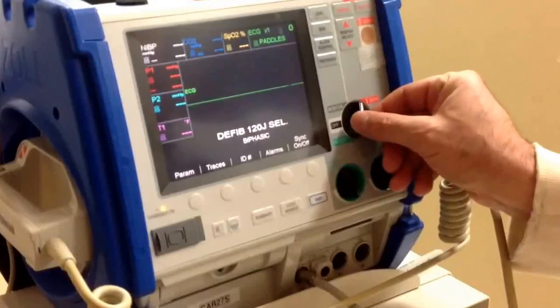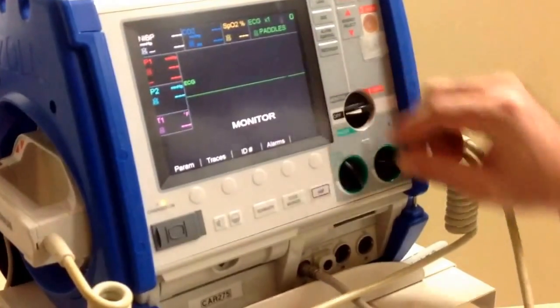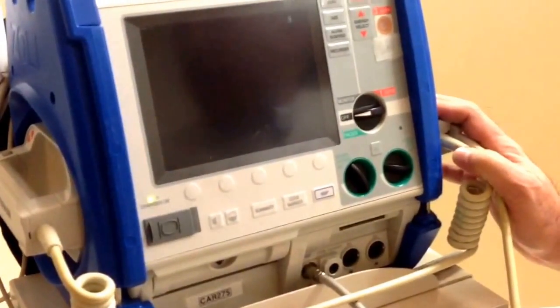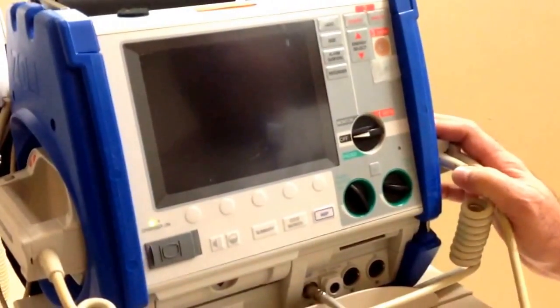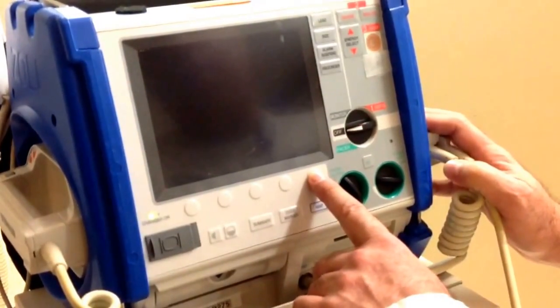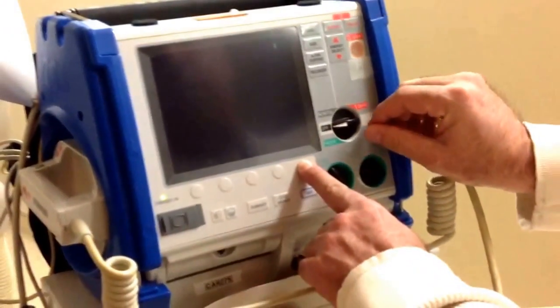First, turn the selector switch to the off position. The monitor must be off for approximately 10 seconds. Then press and hold the rightmost soft key for approximately 5 seconds.